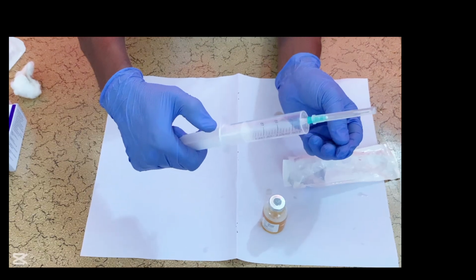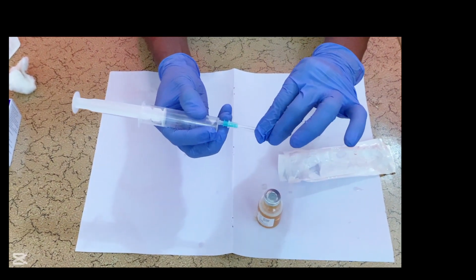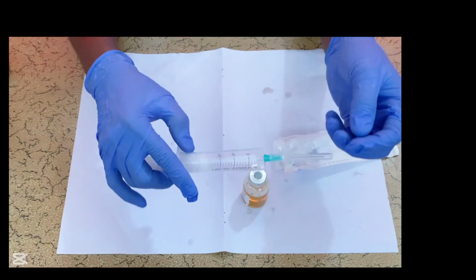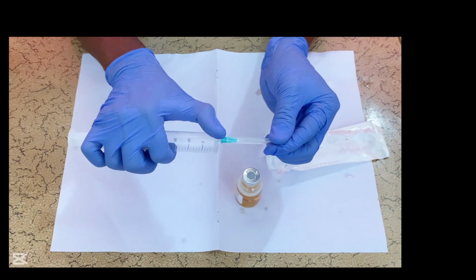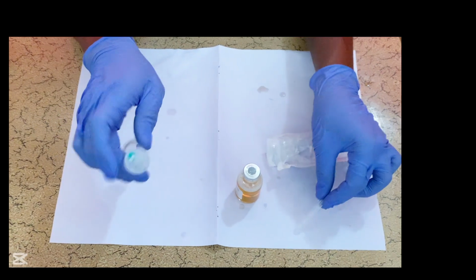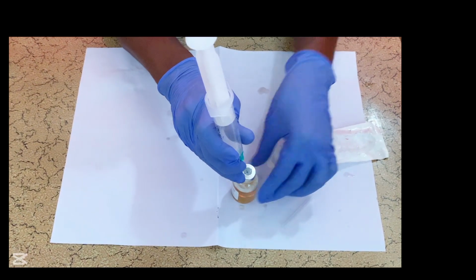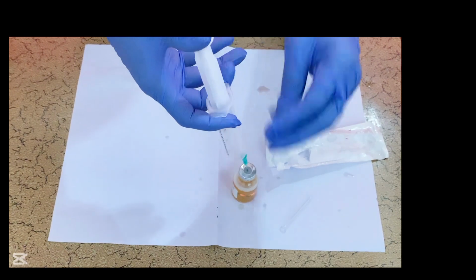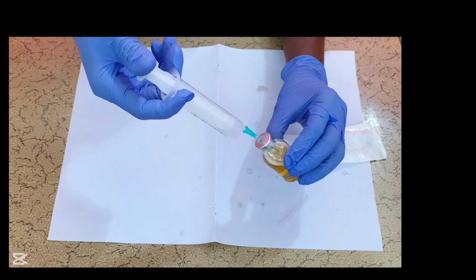Then you remove the cap of the needle. Make sure first you put an equal amount of air into the vial. So you remove the cap of the needle and inject air bubbles into the vial.